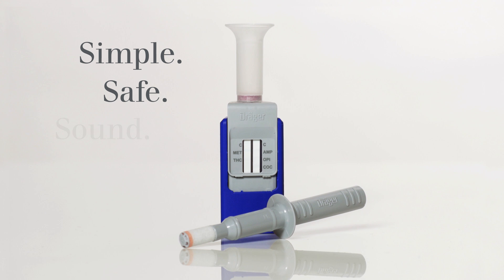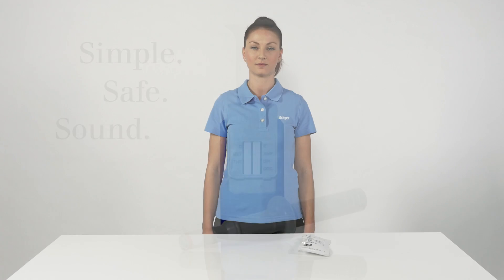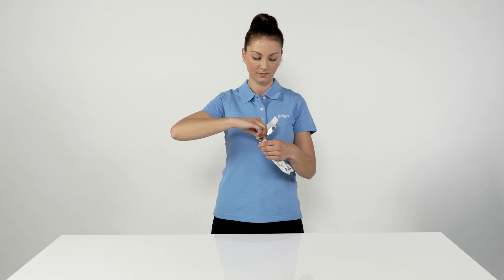The test is simple, safe, and sound — and you don't need a power source to do it. Before you can start with the simple and safe sampling system, you must first remove the test kit from its hygienic individual packaging.